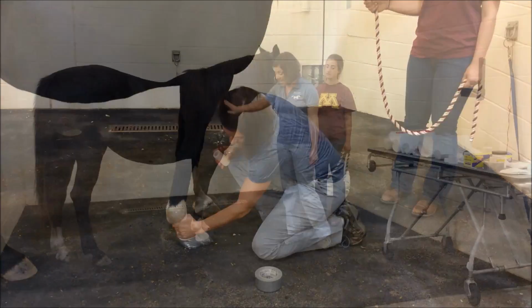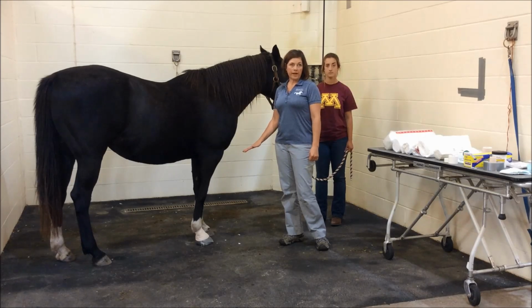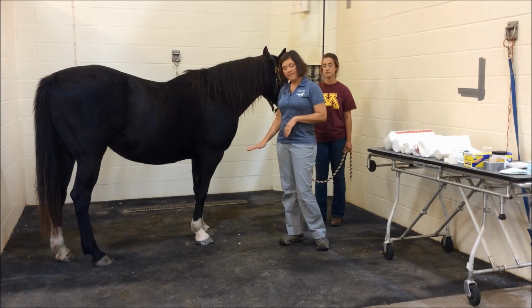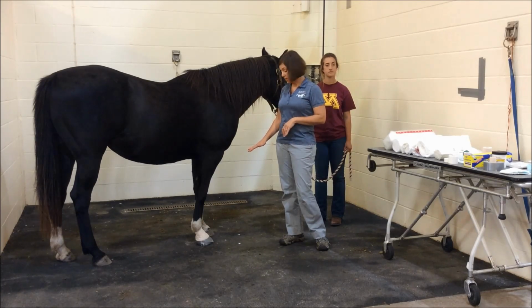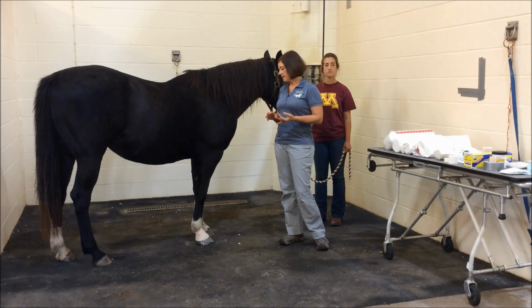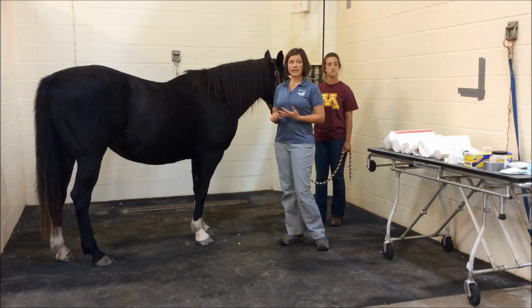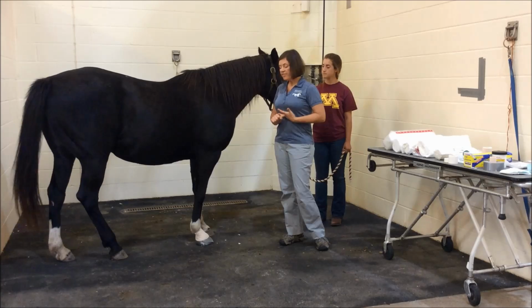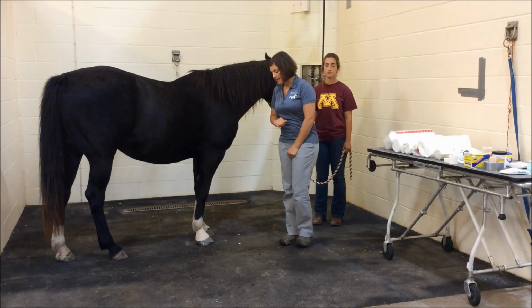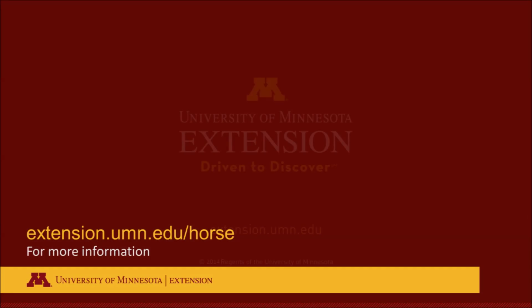With no tension. A couple of last thoughts about the foot bandage. Typically, we're going to leave these on for 24 hours, take them off, look at the foot, and reapply. The poultice pad that we put on may be used in addition to soaking or in lieu of soaking. There are some alternatives you can use to a poultice pad, such as a Magna paste type of product, or people will mix epsom salts with iodine or sugar with iodine. They all achieve the same thing, and that's to help draw the abscess out from the bottom of the foot. But again, we don't want to leave this on any longer than 24 hours.